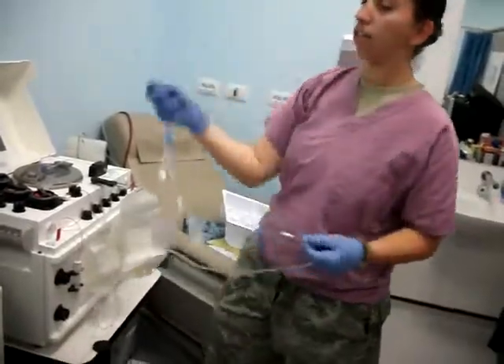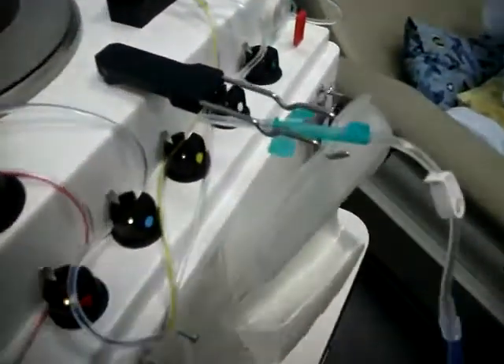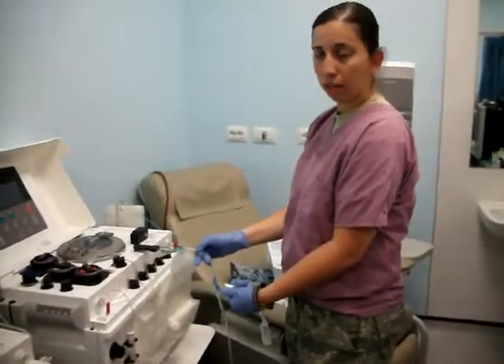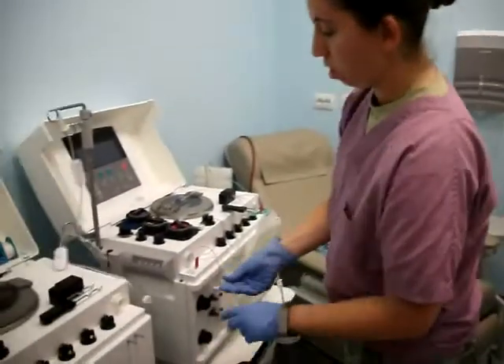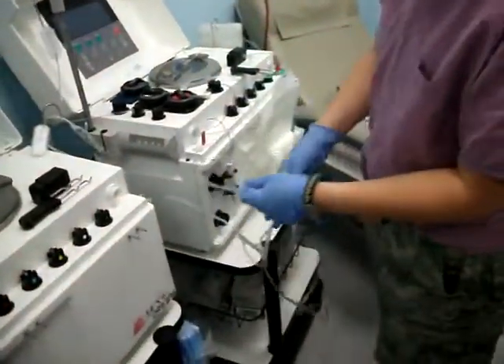Once you have it untangled, you're just going to take your needle and hang it up right there — it stays out of your way. Make sure these two clamps are closed. This part right here goes up there.